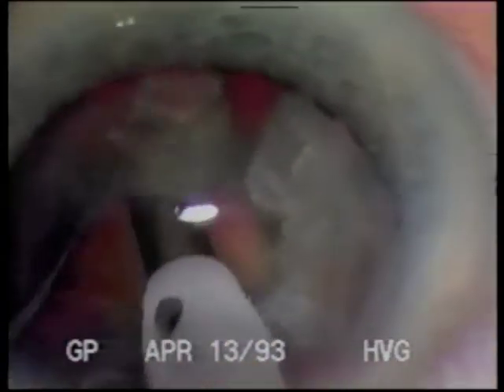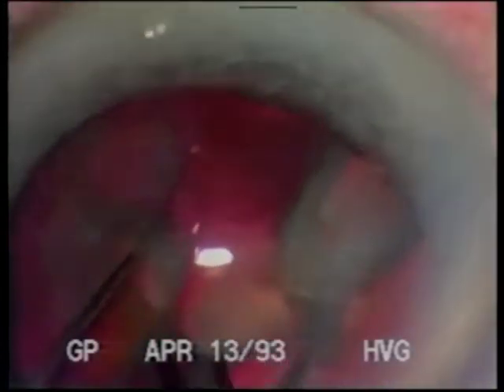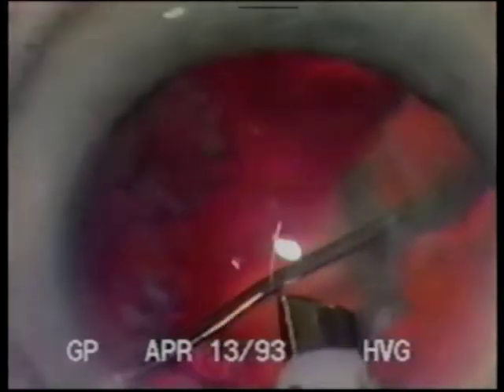The central posterior aspect of the nucleus is reached quickly for efficient fracturing. Once phacoemulsification has begun, the majority of viscoelastic will be aspirated out of the eye. However, a small amount will remain behind protecting the corneal endothelium. Even though phacoemulsification creates turbulence at the tip of the instrument, that turbulence is mostly confined to the capsular bag. Small bubbles will often remain motionless against the corneal endothelium, indicating little or no flow in that area.